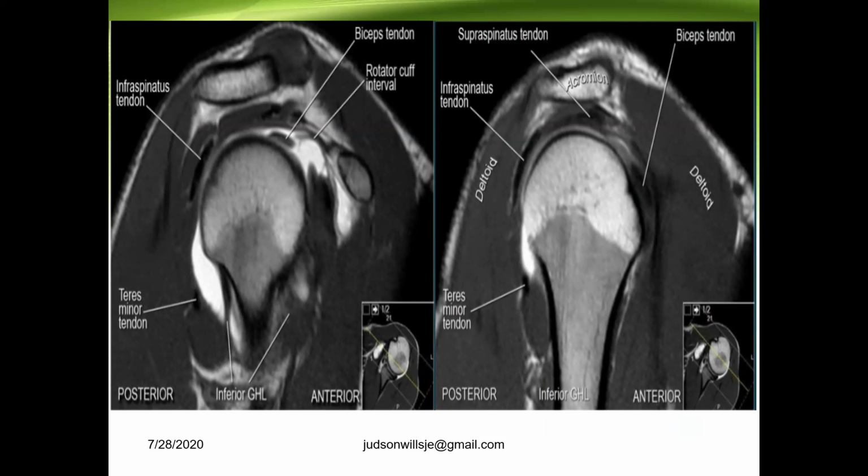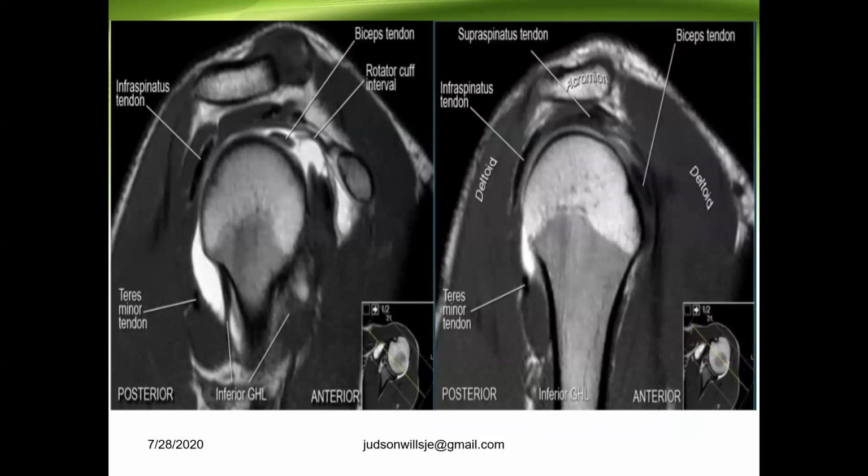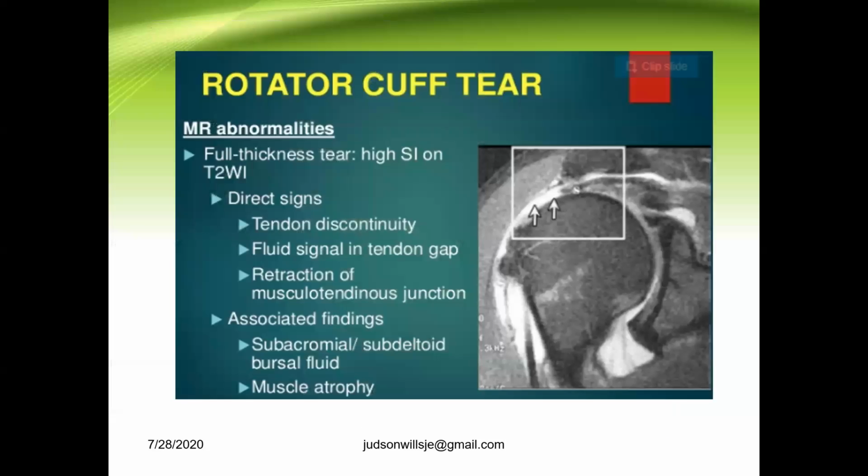But again, we need to cover the entire shoulder joint, from the distal part of the humerus to the scapula, the glenoid cavity. And basically speaking, shoulder joint pain may be due to a rotator cuff tear.